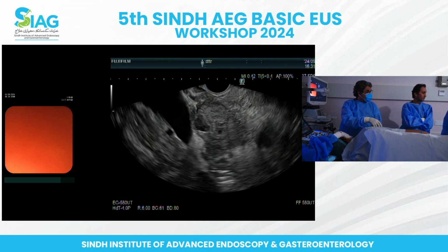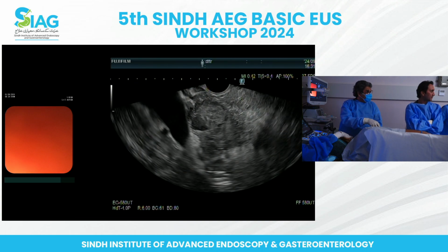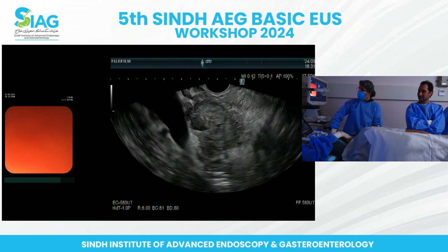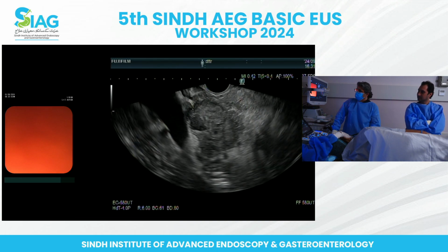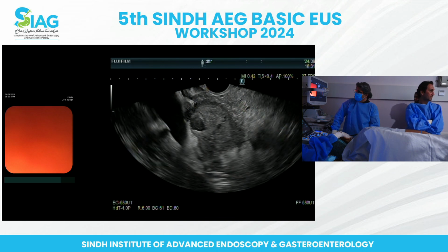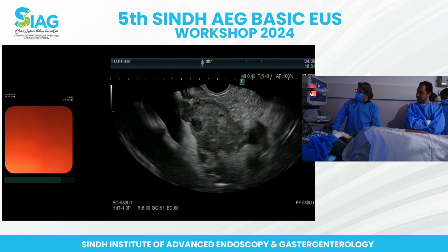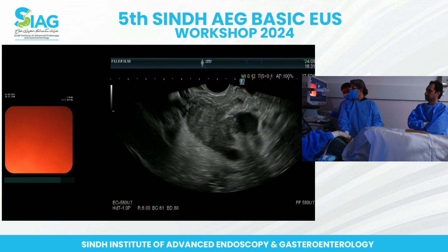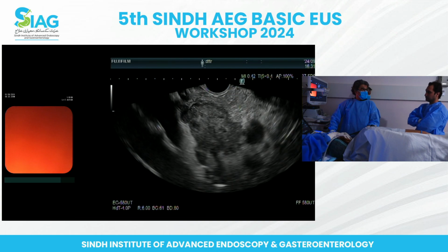We got good cells. Can you ask them to just show the sample, please? I don't pull it out, so they just. Can they just show us the sample, please? All right, just wait a minute. I'm waiting for Wasim to tell us.